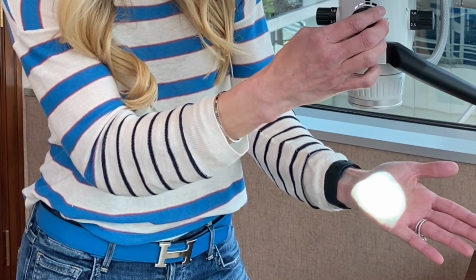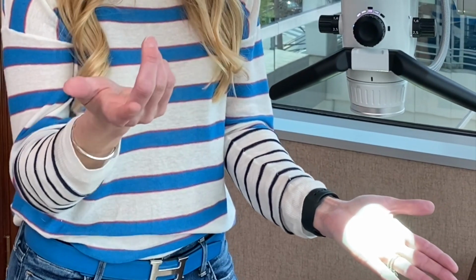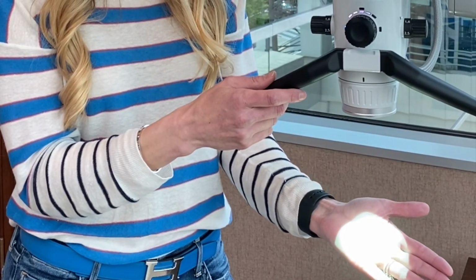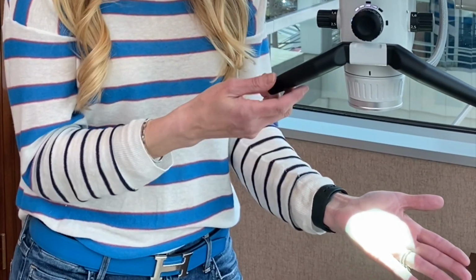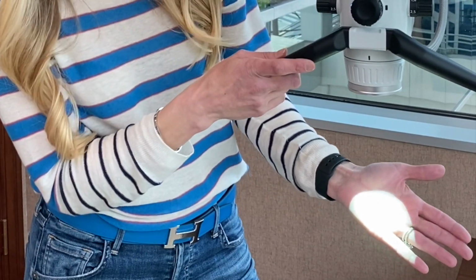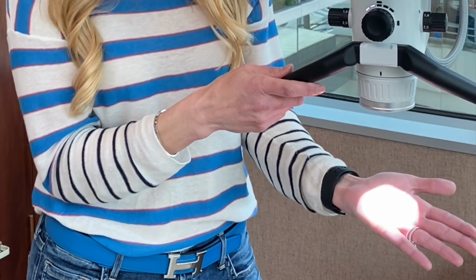This scope also has a green filter, and I don't know that you can see the color very well through this video, but that is essentially for anybody who's working with a laser. So this green filter is just to help protect your eyes during those procedures. Another nice feature about this scope in particular is it does have the option of fluorescent mode, which allows for caries detection. Not all microscopes have that. That is kind of a great feature if you want to use that fluorescent mode for caries detection. I didn't have this installed on this one. So that pretty much sums up the light source.